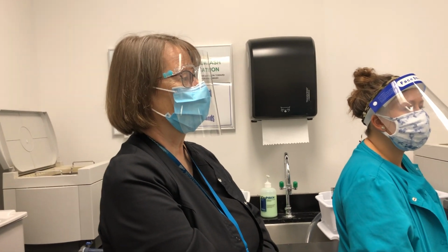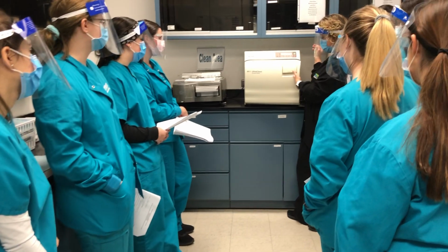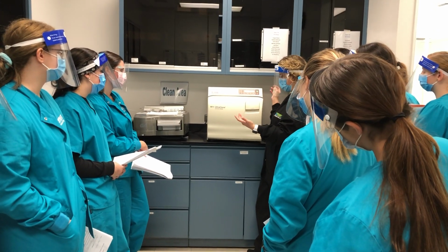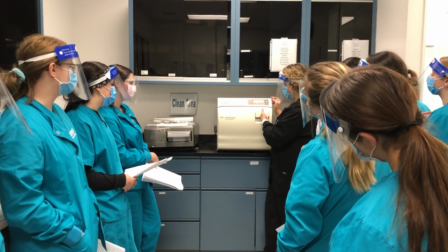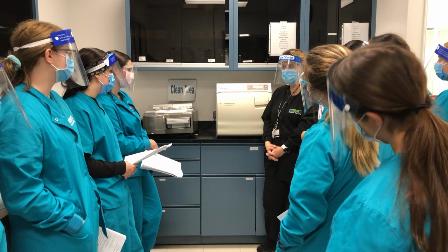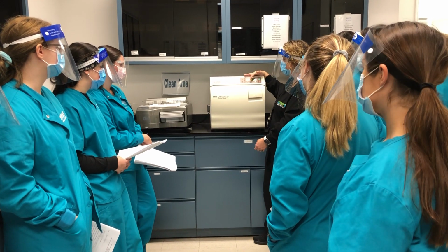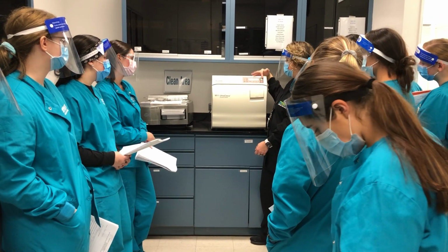So you just slide that back in the tray, and then you're going to close the autoclave. So to close it, you can't just go like this. It just basically hits like a wall. You're gonna lift this, hold back, and then close it like that. Okay? So it has a nice lock. We're obviously not going to start it, but if we were, we would be selecting pouches and hitting start.